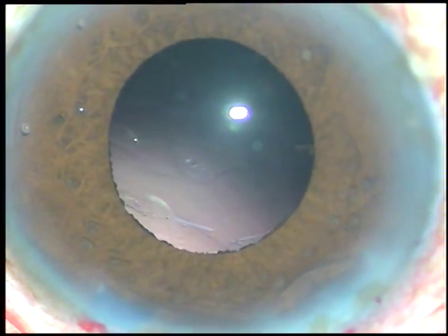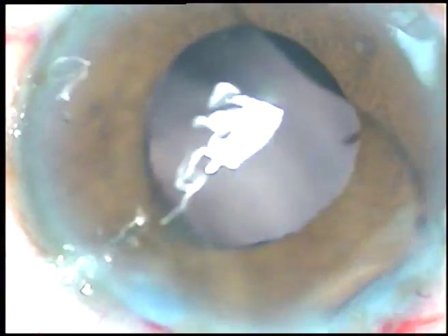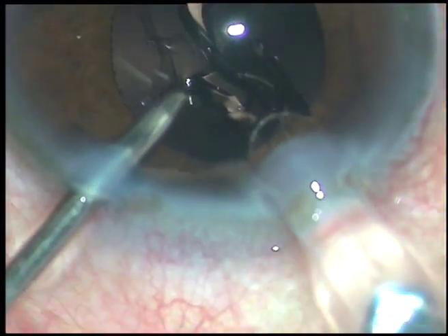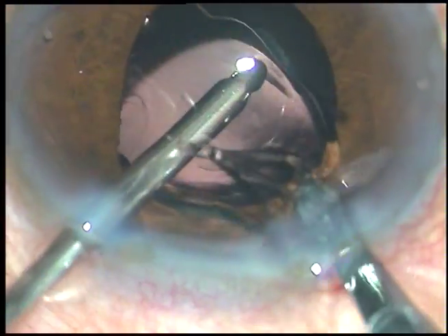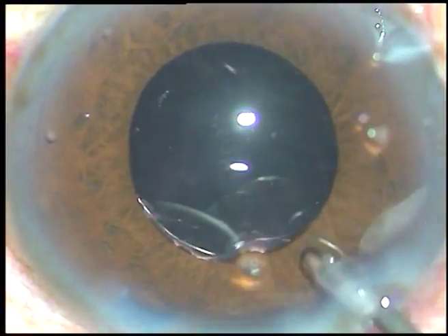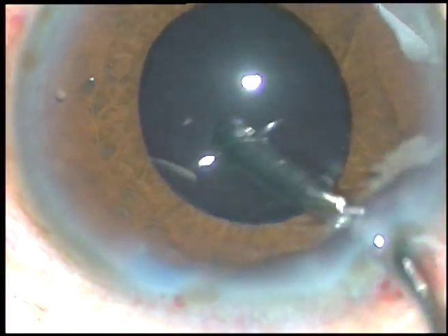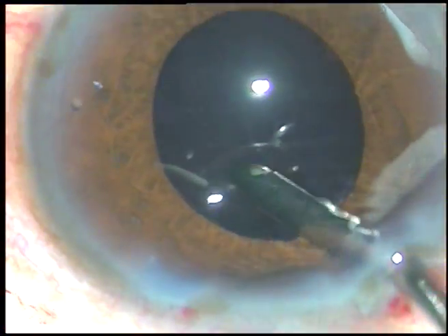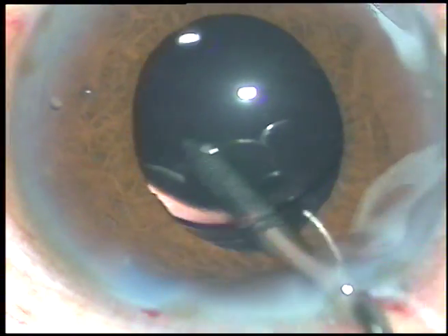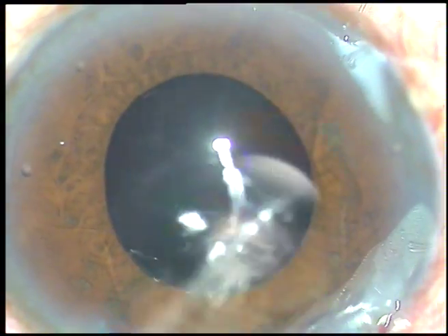The nucleus has been managed nicely. Now we have to put an intraocular lens in the capsular bag. In this case, I am implanting the lens keeping the anterior chamber formed by irrigating fluid. The lens goes into the capsular bag. A rim of anterior capsular rim is seen just in front of the main incision, and that is the guide to confirm that the IOL is in the capsular bag.